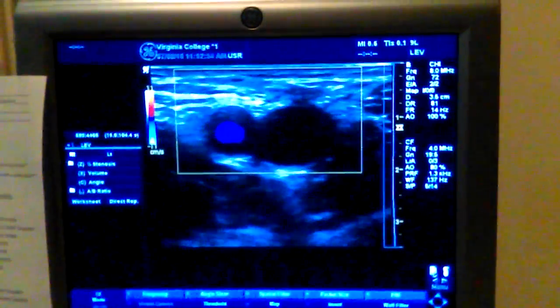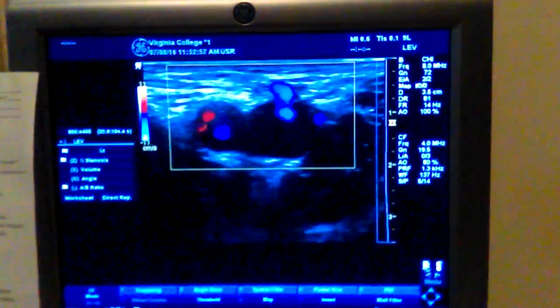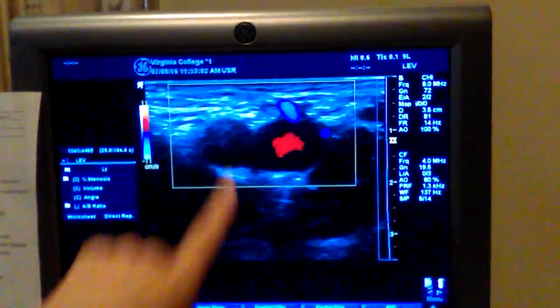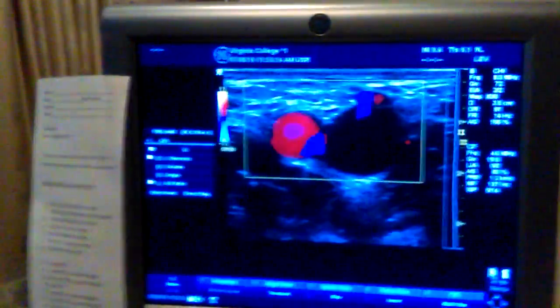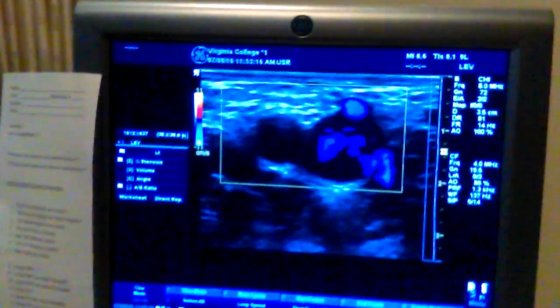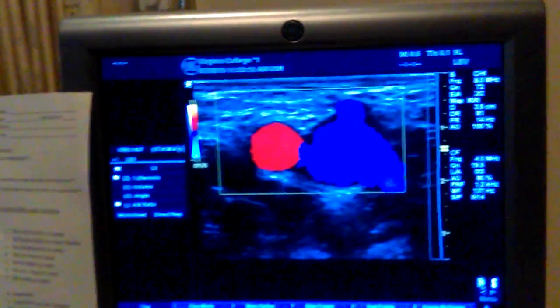And what I noticed on some people's assignments is they were kind of coming straight down at it. See how that's not filling in very well, and when it does, this is red, and that's blue, and everything just looks backwards. Angle your probe upwards. Like if you're having your probe like this, angle it to where the sound beam is going up, because that's the way that the blood flow is going. So angle it up this way, and easy on your pressure, or else you can end up compressing the vein. So we just watch that normal, spontaneous, phasic flow, and there you go.